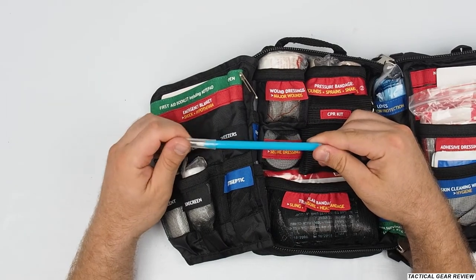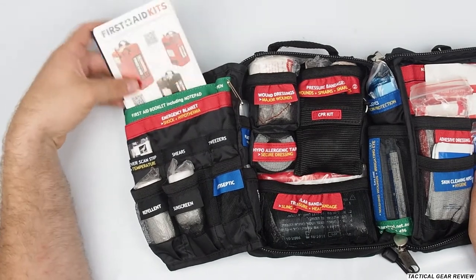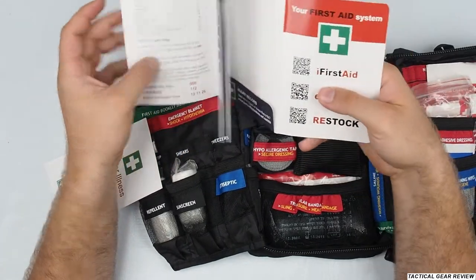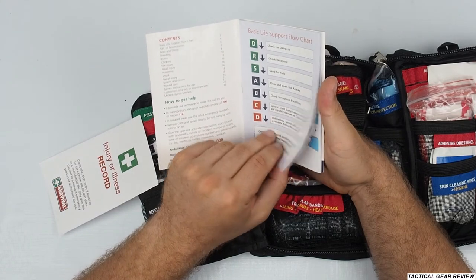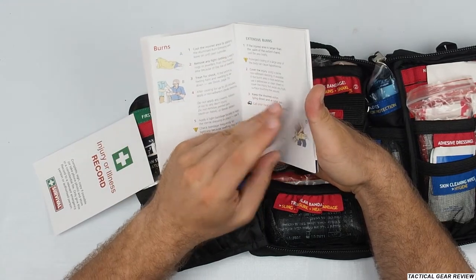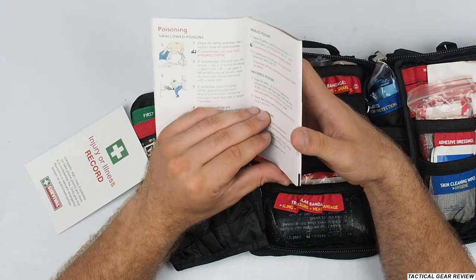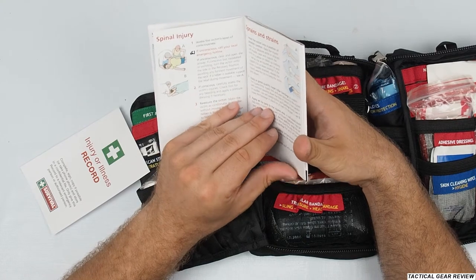You can use the pen to write something in the first aid booklet. There's also a notepad inside where you can write notes. And here, if you don't remember in an emergency situation, you have the basic life support flow chart — CPR, ABC, and so on. You can look up how to stop bleeding, handle bites and stings, choking, and more. I do recommend having such a reference booklet in your first aid kit. There's also an injury and illness record where you can fill in the victim's name, medical history, and other info, then hand it to the paramedics or ambulance that arrive. So the pen is really useful here.